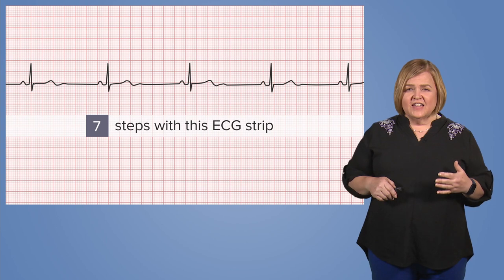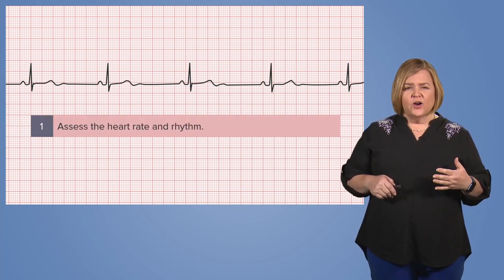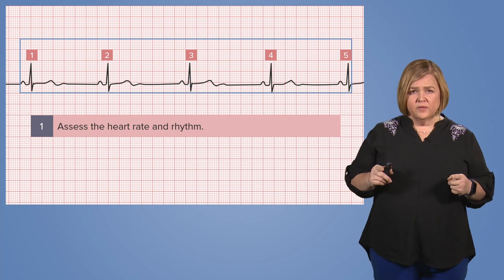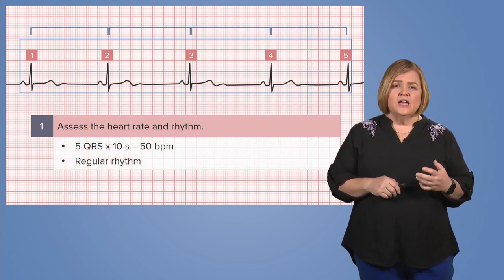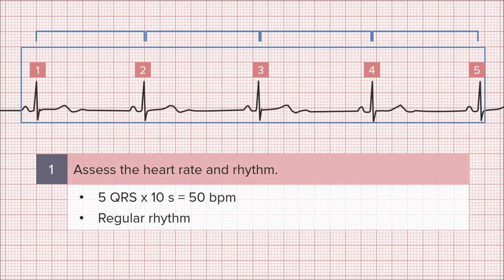Now we're going to walk through this strip using the seven steps. First, assess the heart rate and rhythm. Find a six-second section of the strip, count the number of QRS complexes, and multiply that by 10. Use this strip as an exercise and match your answer to the one you see on the screen.